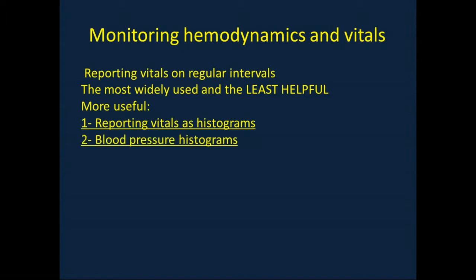And particularly blood pressure histograms are very helpful to guide early weaning of cardiovascular medications. Reporting vital signs as trends, and also blood pressure trends, can be very helpful to guide pathophysiologic, targeted logical treatment and selection of appropriate cardiovascular medication, and also early weaning.